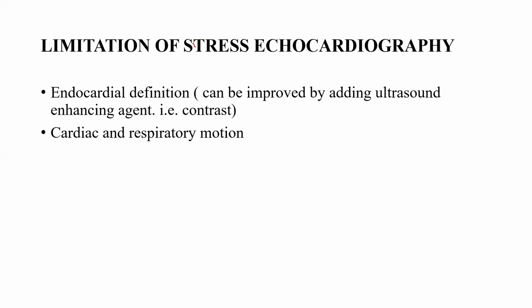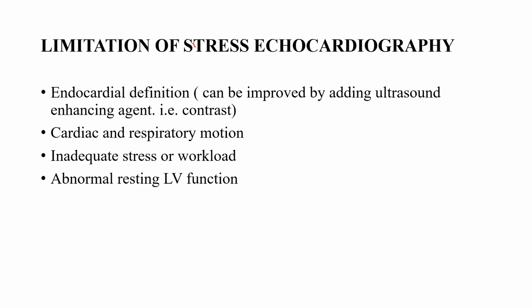Now, a lot of cardiac and respiratory motion. Imagine someone running on a treadmill, and afterwards you have to evaluate the heart, the respiratory parts, and the breathing, the deep breathing in and out can make imaging quite challenging. And you may have inadequate stress or workload, which will influence your interpretation of the results.